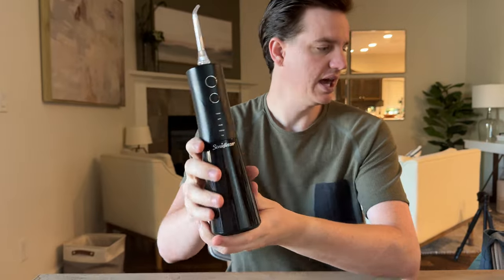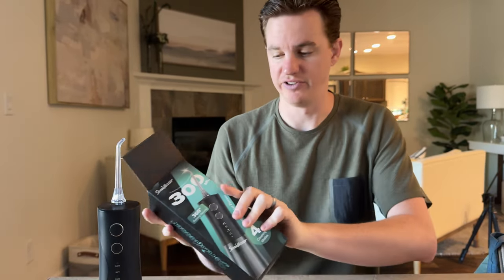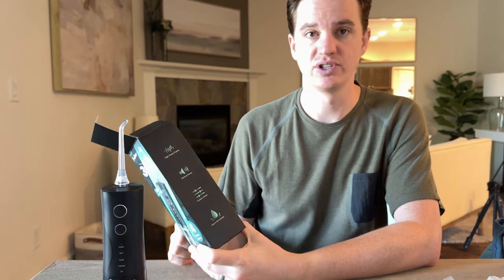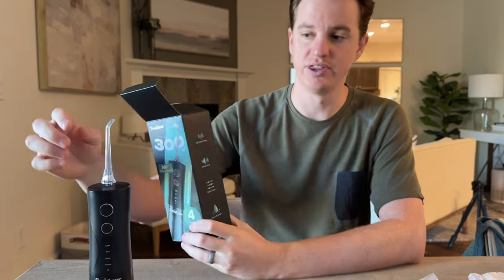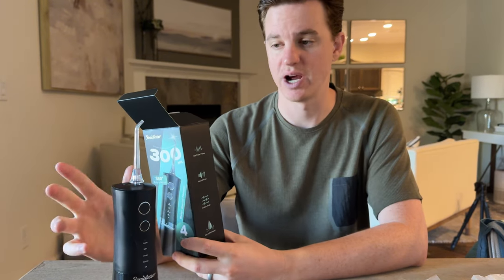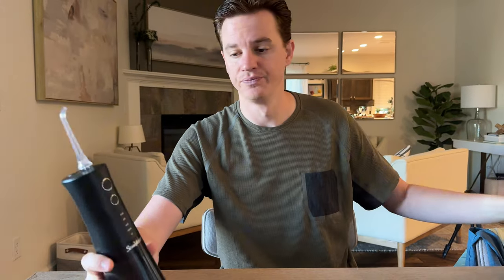On the front there's the on/off button and the mode buttons. Refer to the box because there are actually a lot of features — it has minimal noise, it's safe to use in the shower, it has custom modes, a high power pulse, and the nozzle rotates. There are four cleaning modes and it's waterproof, so a lot of really nice features.